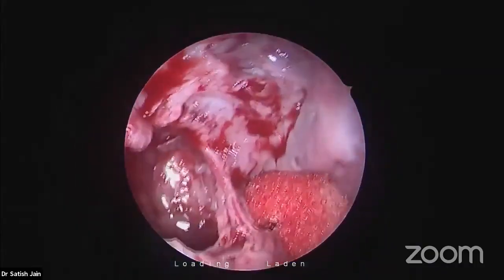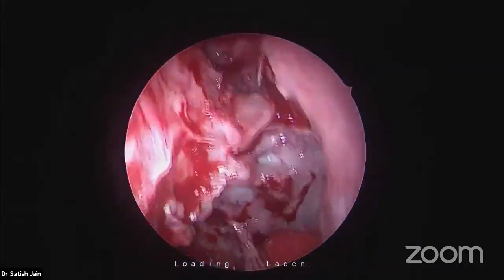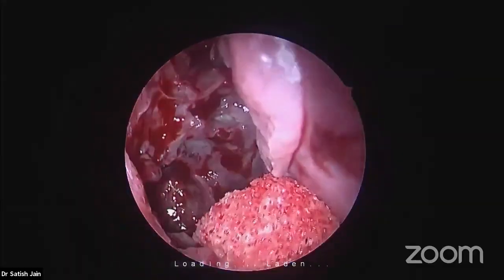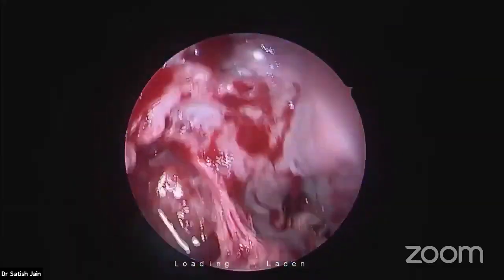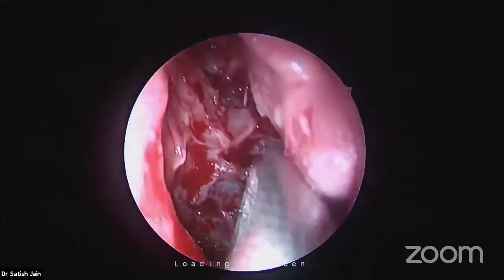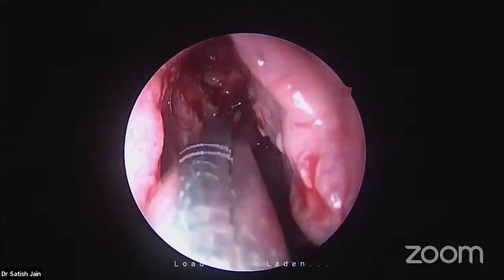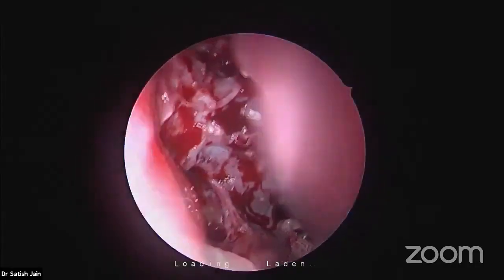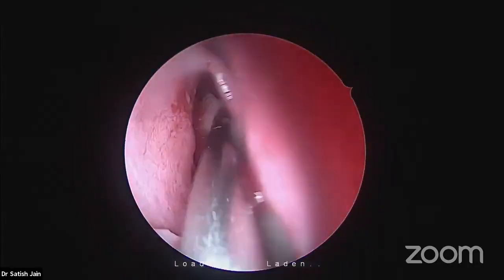They drain behind it. So it has anatomical as well as physiological importance, this ground lamella. Can you see the ground lamella completely? How to know whether there is any retrobullar recess present or not? It was the retrobullar recess where I fractured the bulla from behind.